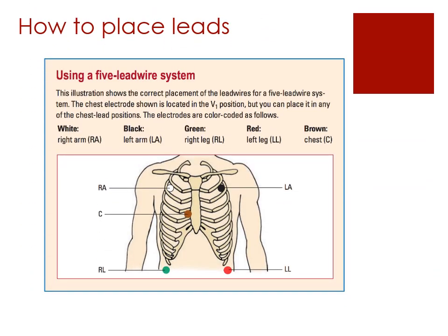Now, you might be asked to put telemetry on a patient, and so this is how you place your telemetry. We have mnemonics. White is right, so white goes on the right side. Smoke over fire, so the black is on the left side. So when you look at the lower levels, if it's smoke over fire, the red goes below the black. Then there's air over grass, and so white is air and green is the grass, so the brown goes in the middle.